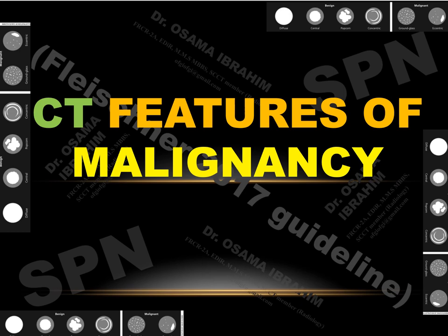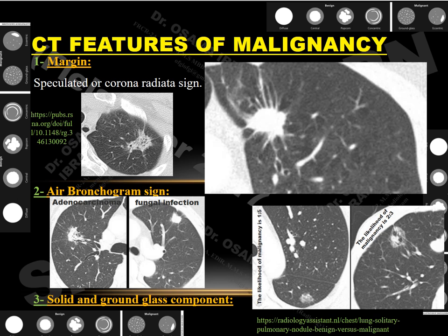Let us examine the CT features of malignancy to discriminate benign from malignant solitary pulmonary nodules. The first and most important feature is the margin. If the solitary pulmonary nodule has corona radiata or spiculated margins — as seen in these solid nodules — this raises the possibility of malignancy. Even ground glass nodules with corona radiata or radiating margins are highly suspicious for malignancy.